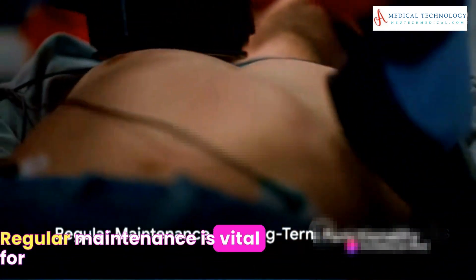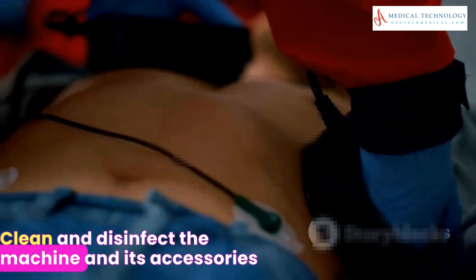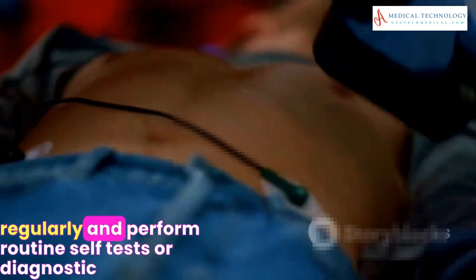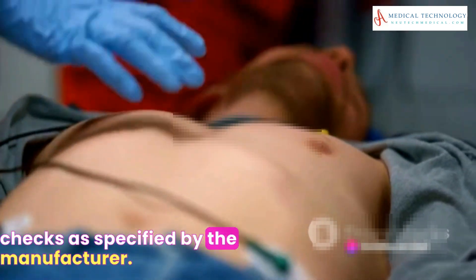Regular maintenance is vital for the defibrillator's long-term functionality. Clean and disinfect the machine and its accessories regularly, and perform routine self-tests or diagnostic checks as specified by the manufacturer.